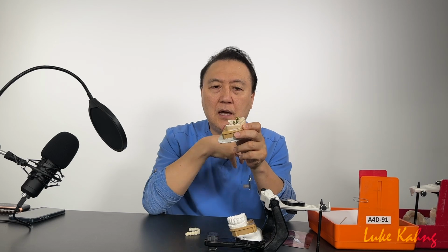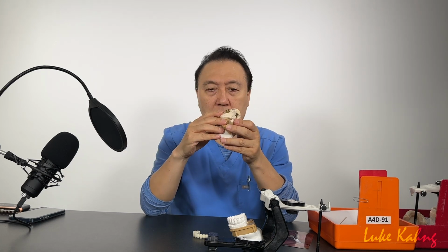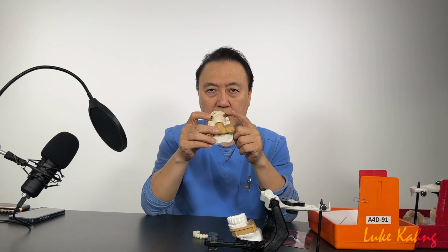Here's my goal. I want to get as perfect as possible. Number one, longevity. Number two, cleansability. Number three, aesthetics. That's why we have to make this. So after we make the custom abutment, which we mill here, and this is Bio Horizon, we made hex because I cannot make non-hex. The doctor has to put it in the patient's mouth like that.